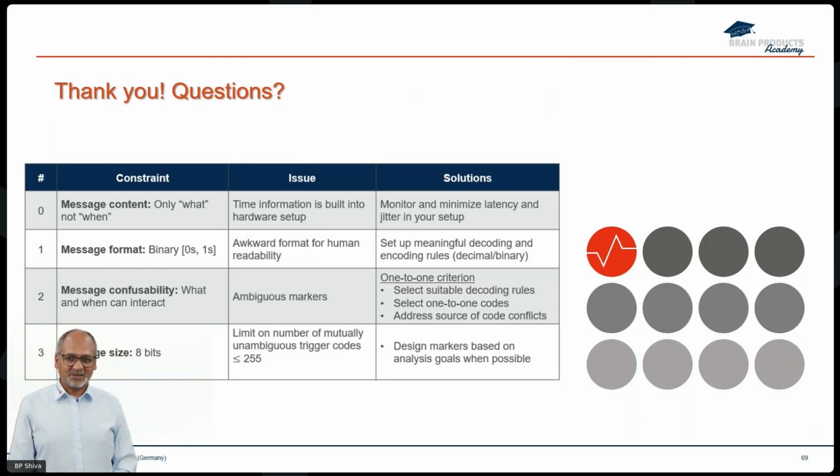It's tempting to skip the error responses, but the record of markers is meant to capture where there were events occurring, whether they are correct or wrong. So if you skip the error trials, it looks in your EEG data that nothing happened there. This can be very problematic for analysis where that assumption might actually be false.